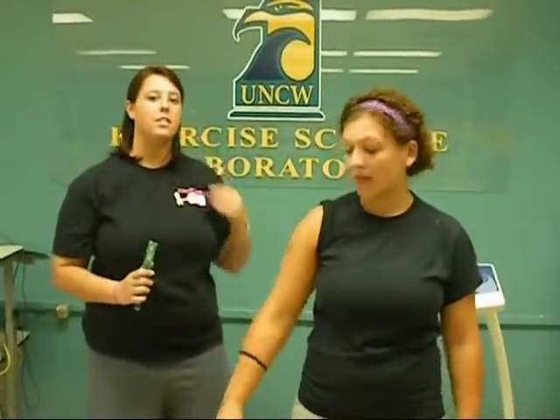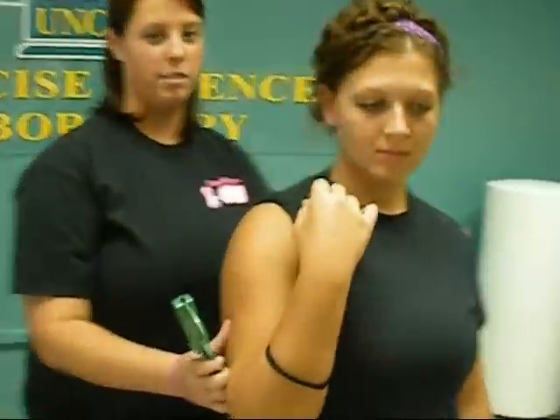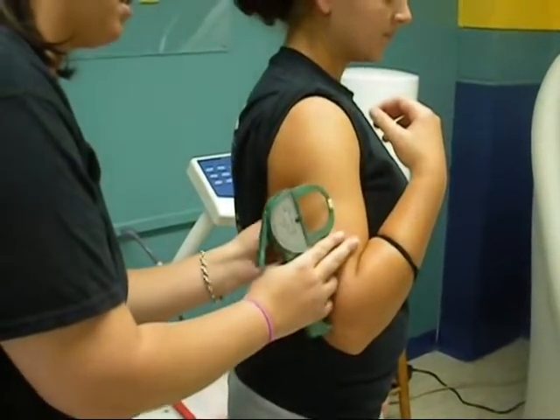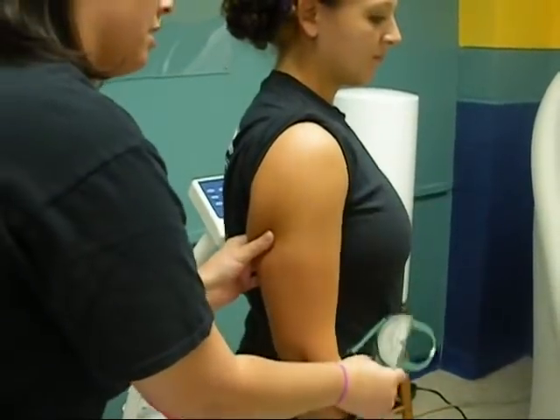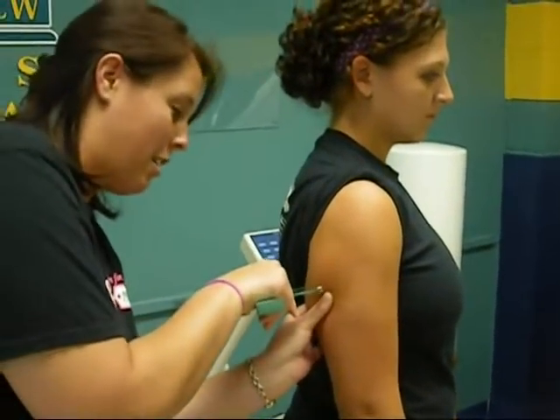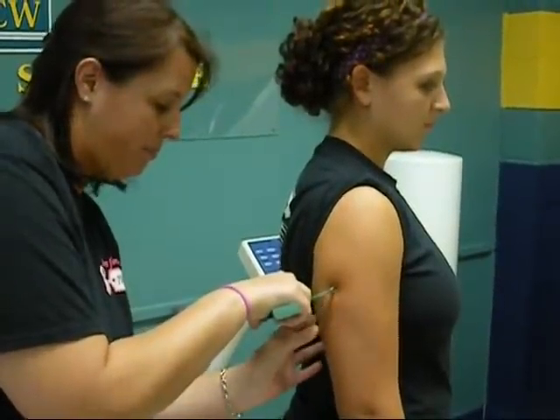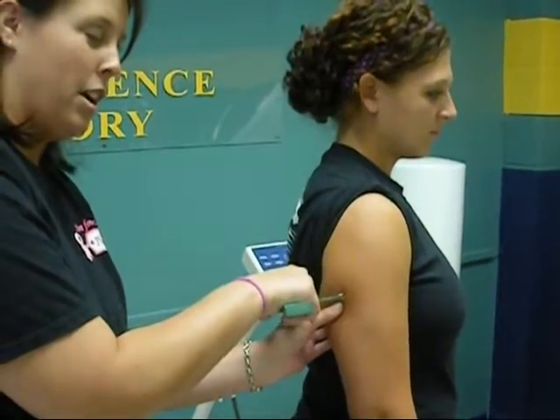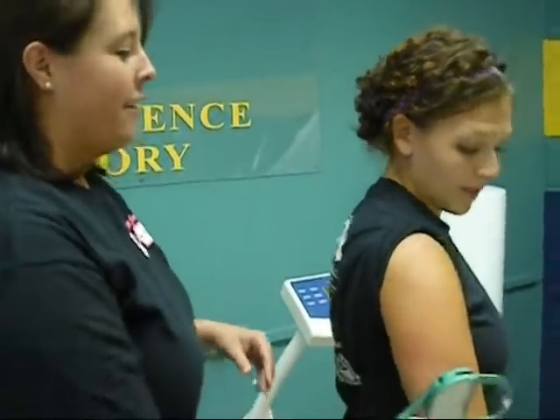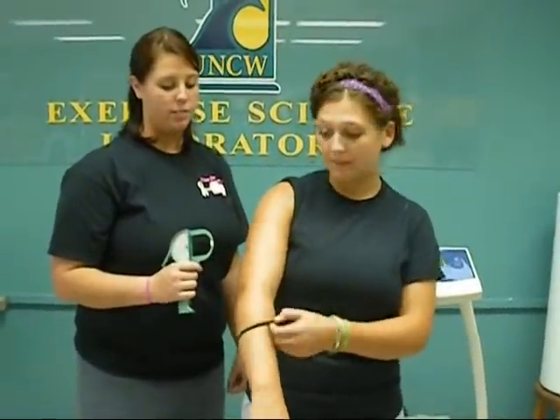The first site is going to be on the tricep. First, you're going to fold your arm and try to find the fat, separating the muscle from the fat. Then when you find it, relax, take your caliper and measure it. Make sure you grab it again before pulling the caliper off because it will hurt and pinch. Make sure your arm is not tense so you get an accurate measurement.